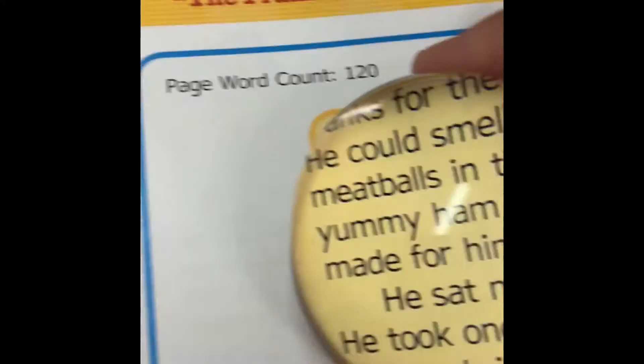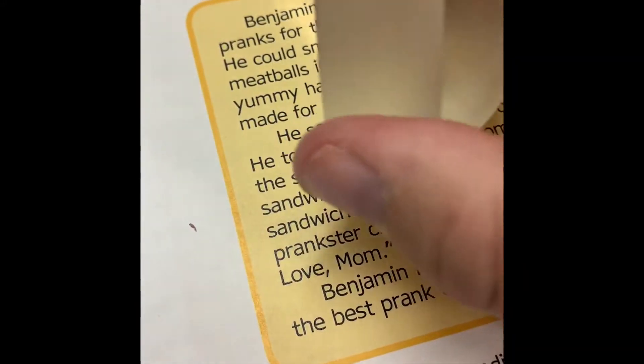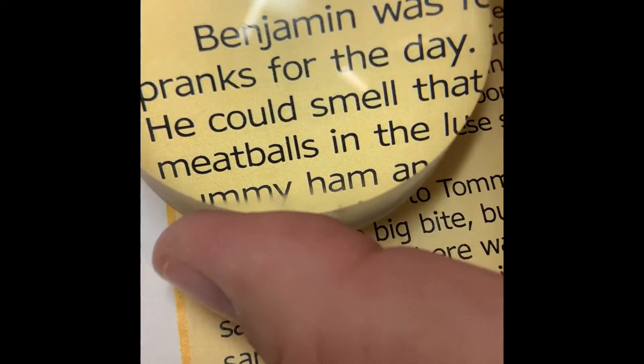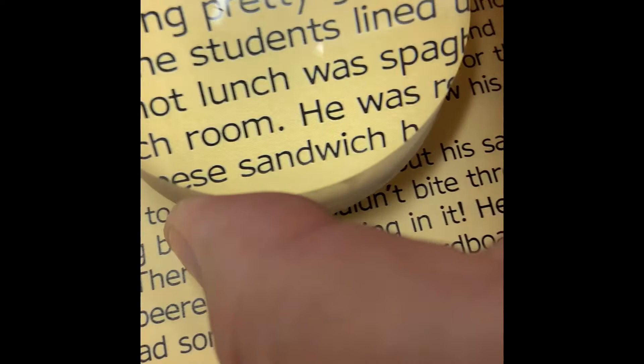Remember, when you hold your dome magnifier, always hold it from the side. When you're reading with your dome magnifier, you want to follow the sentence.